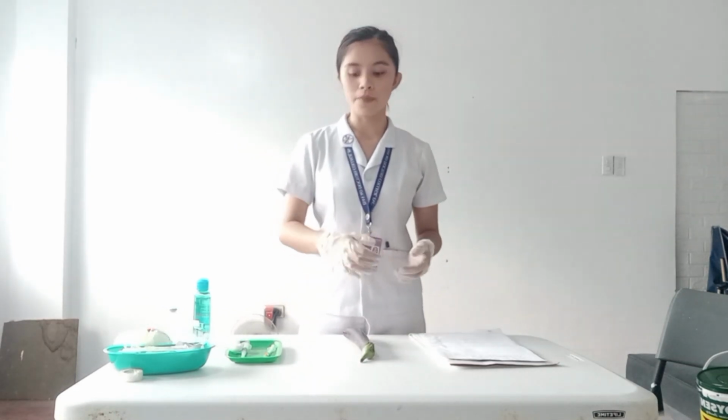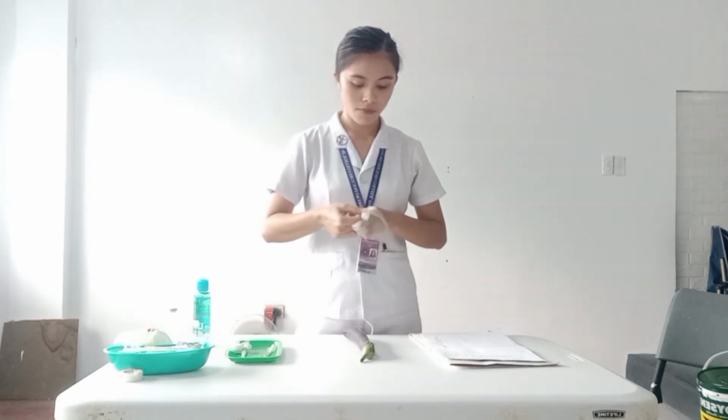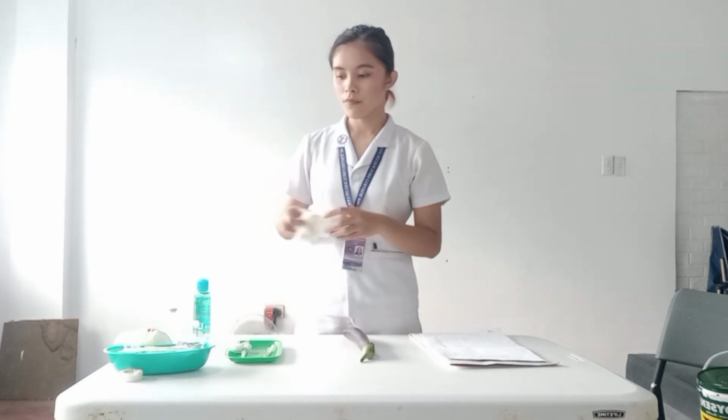So now dispose the used syringe. Do not massage the area because it can disperse the medication into the tissue or out through the needle insertion. So I can now remove and discard my gloves. Do not recap the needle in order to prevent needle prick injury. Then I have to perform hand hygiene to deter the spread of microorganisms.